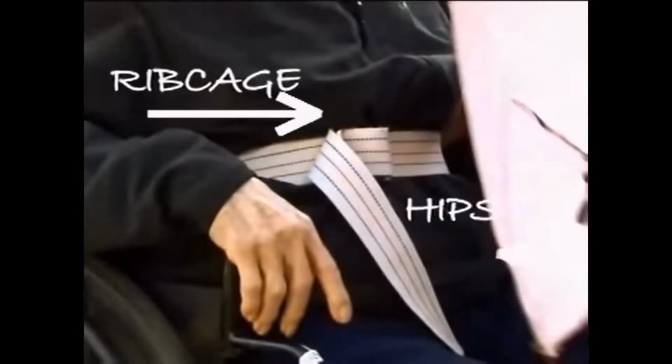Have the individual lean forward and apply a gait belt or other belt. The use of a gait belt provides increased safety by allowing you to hold onto the belt rather than an arm, which may cause injury to the individual. The belt should be applied around the waist, below the rib cage, and above the hips.